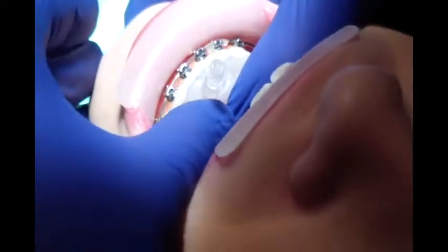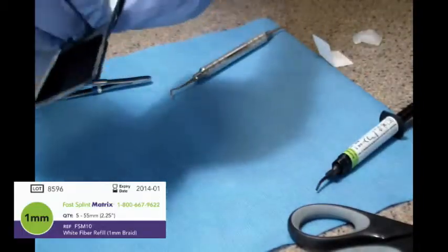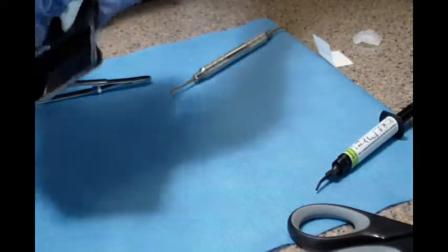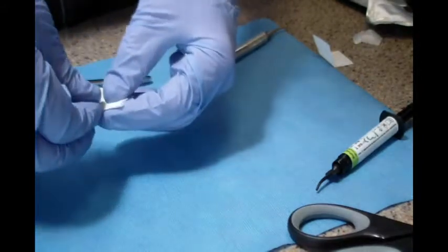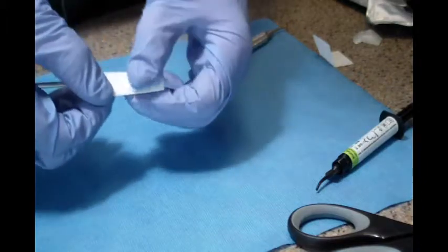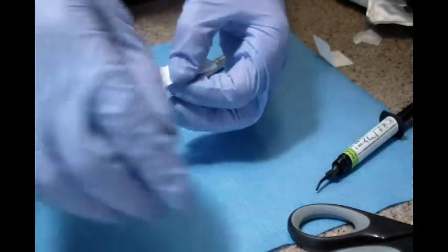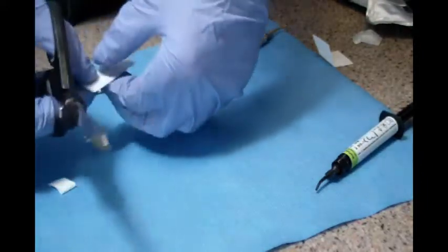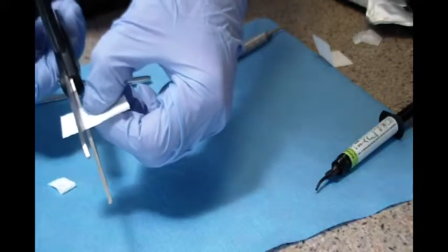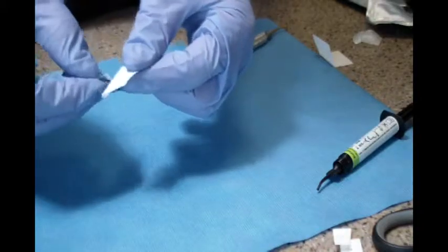Verify the fit of the index to ensure the retainer will be placed in the correct position. Remove a strip of FastSplintMatrix compressible fiber from the package and position the wax strip on one side of the protective plastic covering over the fiber bundle, leaving it short of each side of the strip. Using scissors, trim each side of the fiber strip at the position of the wax strip. Remove the wax strip and set it aside.